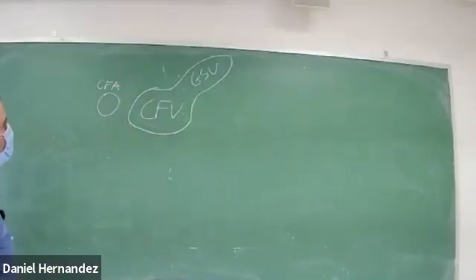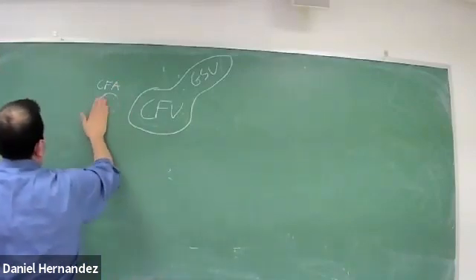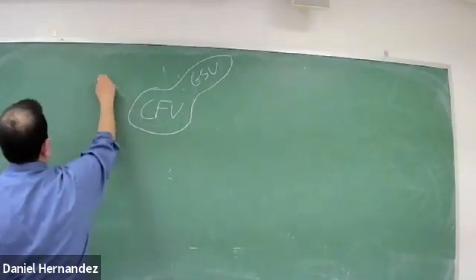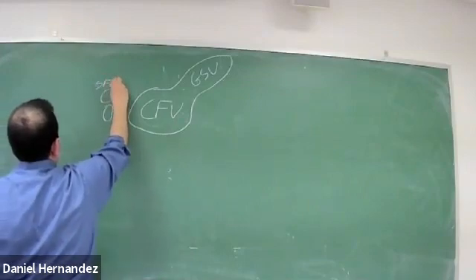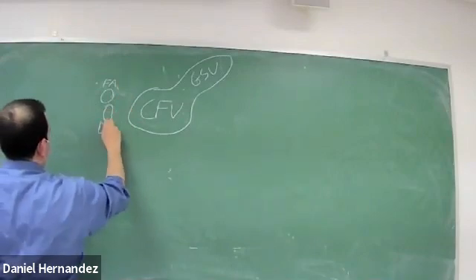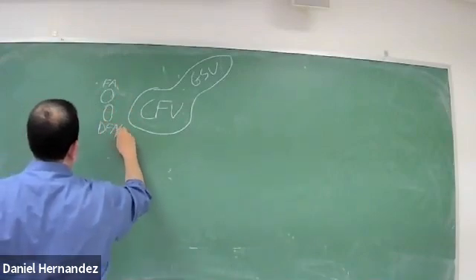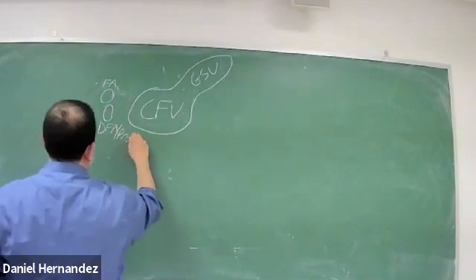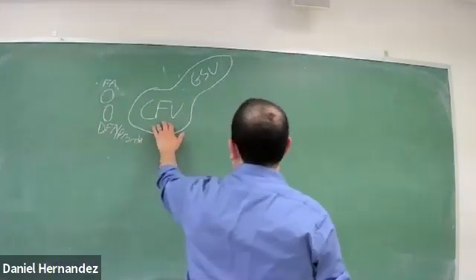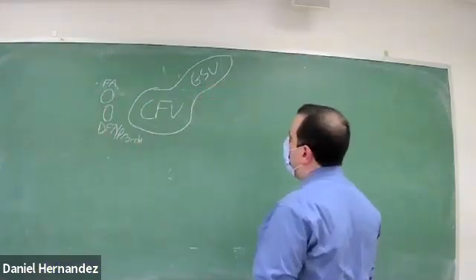This is going to be our common femoral artery. If we see two vessels, two arteries, we have our superficial femoral artery or SFA, and this would be our deep femoral artery or profunda, the bottom one. To know that this is our common femoral vein and greater saphenous vein.